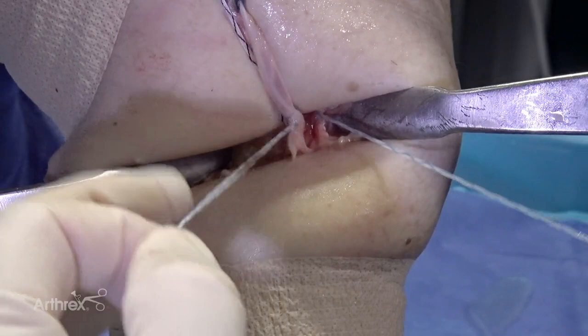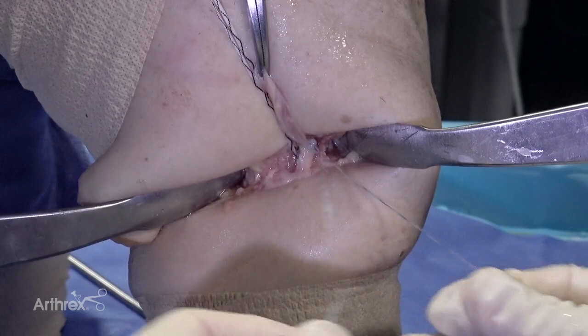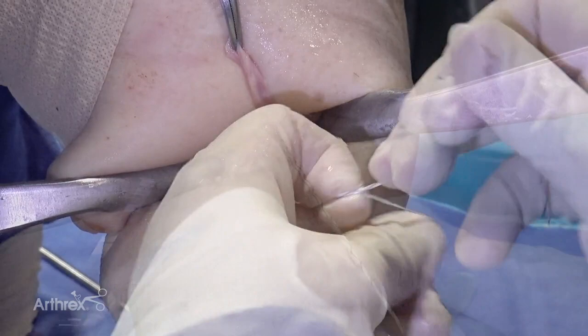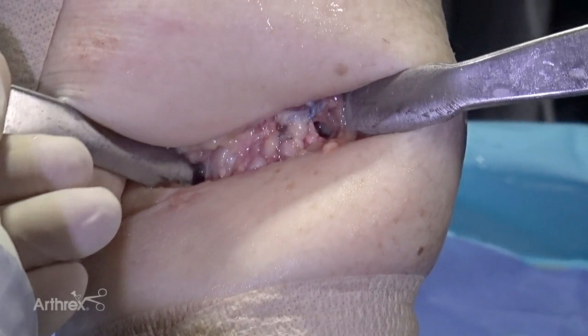We then hold the biceps proximally. I pull the one limb and that'll actually juxtapose the tendon to the bone and then just tie accordingly. And always remember to at some point reverse your post so you get better internal friction and locking of the knot. So I pull the post limb, which is the limb that's not going through the tissue. That pulls the tendon to the bone and then we suture it down. And then I always leave a little bit of a stump of tendon when I'm done. And that's it. That's an open subpec tenodesis using the FiberTak biceps anchor.